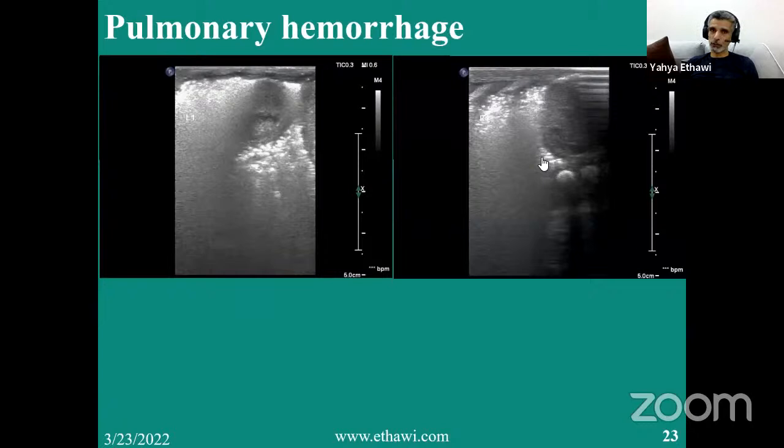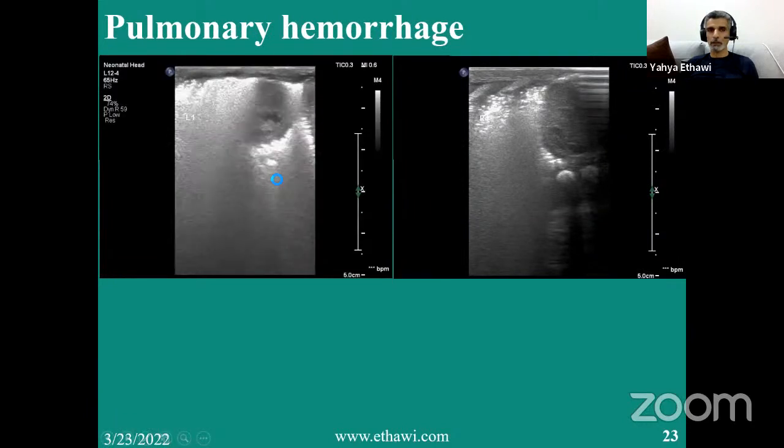Now we finish with bronchopulmonary dysplasia.